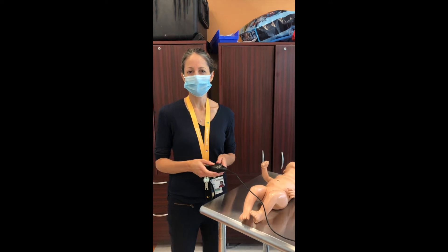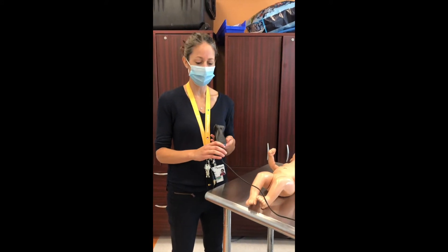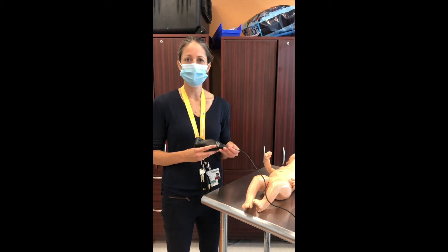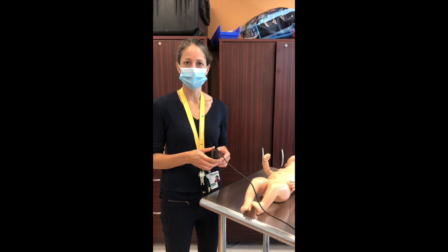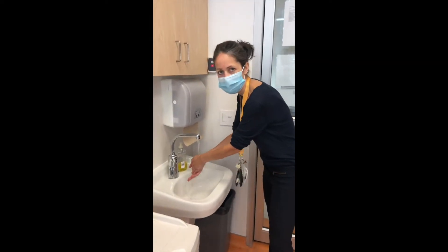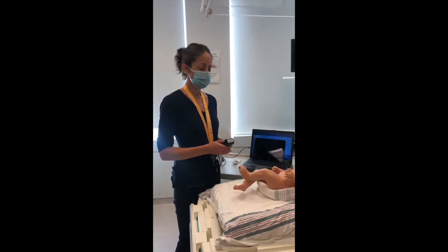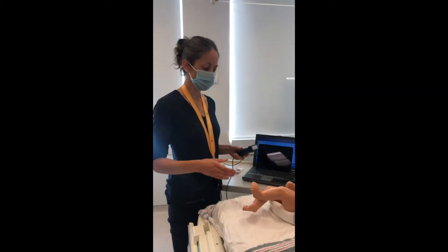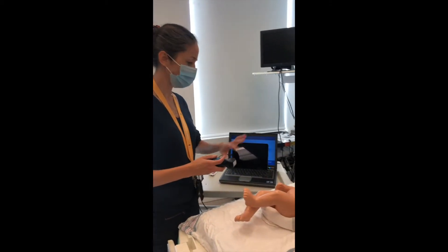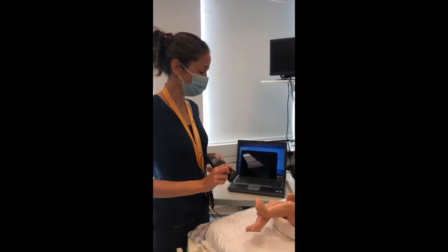Hi, I'm Anita Point, a neonatologist at Chus Saint-Justine. I'll be presenting you how to do the views for the cardiac ultrasound. The first thing I do, I wash my hands. The next step, you need to be at the bedside and you need to install everything that you will be using during the echo.